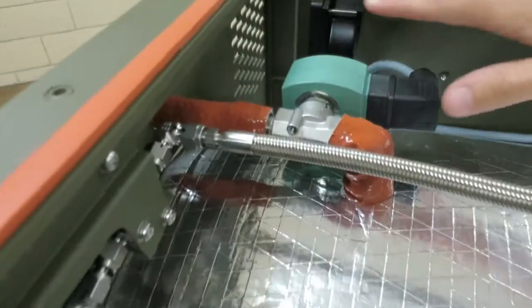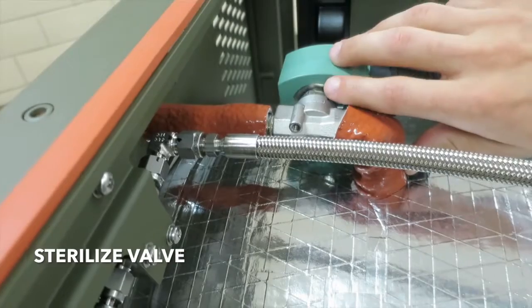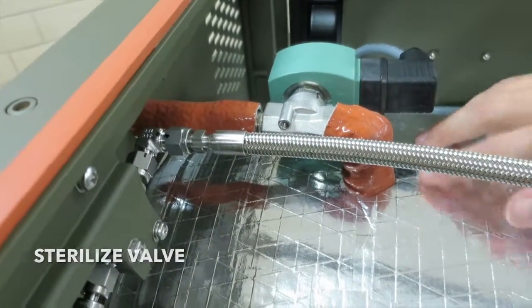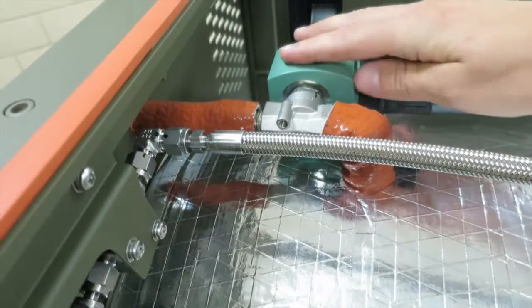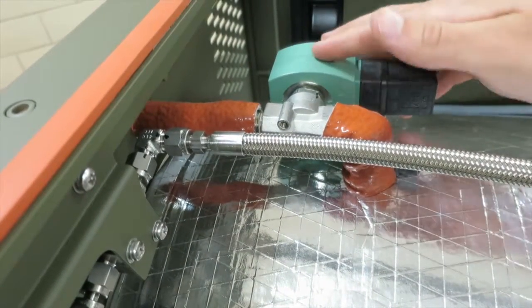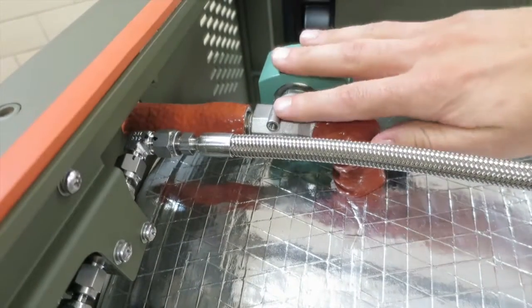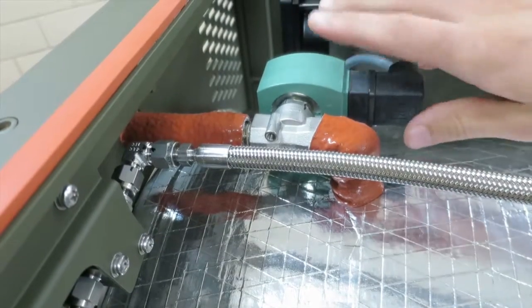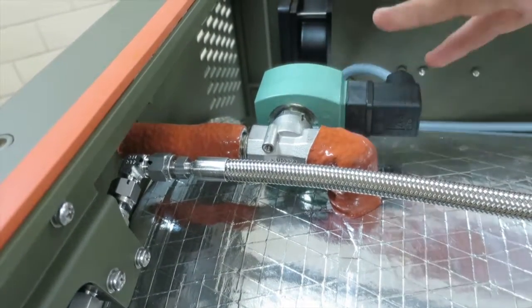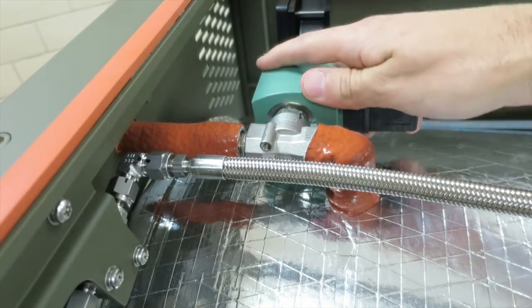Over towards the back, we have the STERILIZE valve. Anytime steam is jumped from the jacket through this valve down into the chamber, this valve opens. It's a solenoid valve just like the rest of them. During exposure, this valve is open. During the conditioning phase, when you are doing a steam flush, this valve is open. Anytime you're doing a steam pulse, this valve is open.